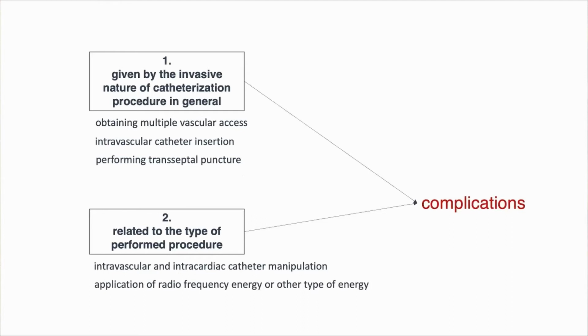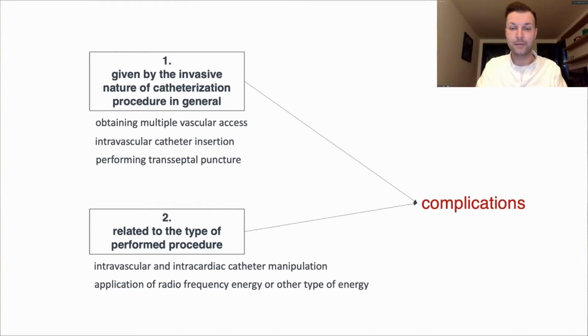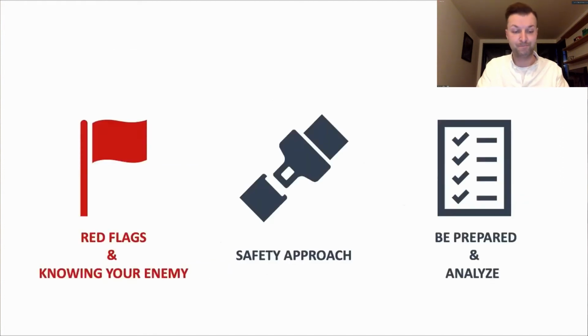Firstly, given by the invasive nature of catheterization procedure in general, for example, obtaining multiple vascular access, intravascular catheter insertion, and performing transeptal puncture. And secondly, related to the type of performed procedure, intravascular and intracardiac catheter manipulation and application of radiofrequency energy.